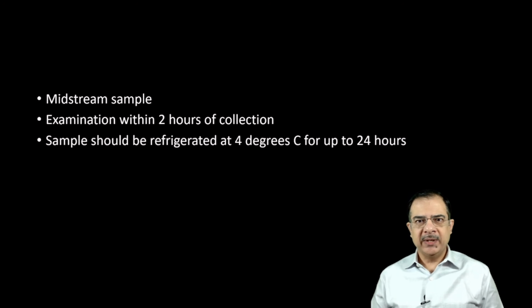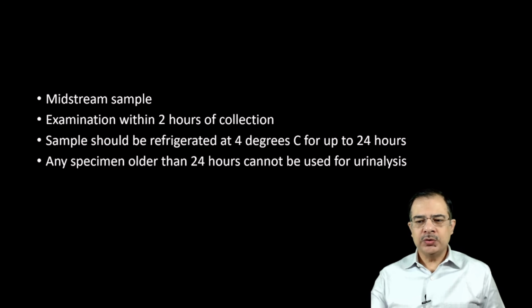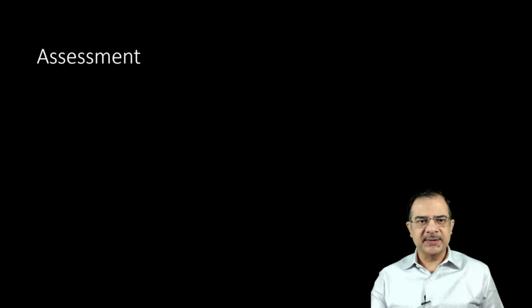In a clinic, when the patient comes in late evening, the lab might be closed. So in that case, this will be a very useful technique to preserve the urine sample. Any sample which is older than 24 hours should not be used for urine analysis.